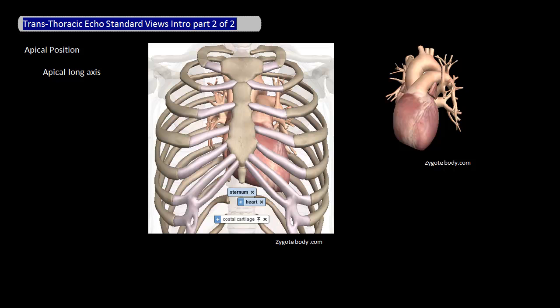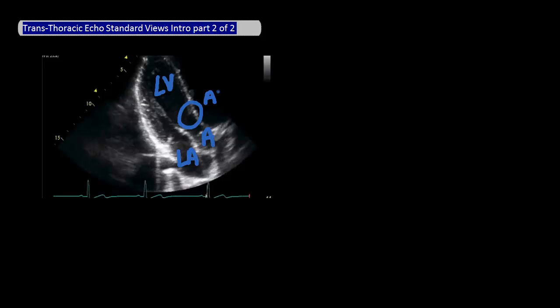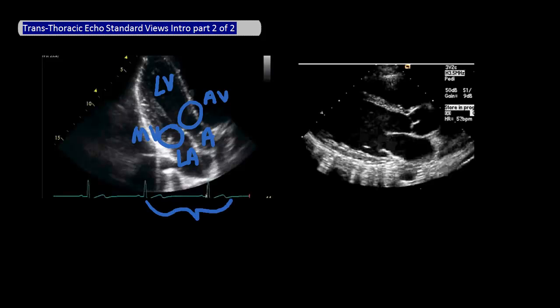The eighth and last view is the apical long axis, which is at the apical position. This view is the exact same view as the parasternal long axis view, except that it's rotated 90 degrees. Not surprisingly, the cut across the heart is across the left ventricle and aortic valve. Here's an echo example. Because it's an apical view, the left ventricle will be up top, the left atrium will be down here, the aorta will be here, the aortic valve will be here, and the mitral valve will be here. If you compare the apical long axis to the parasternal long axis, you can clearly see that it's really the same view, just rotated 90 degrees.